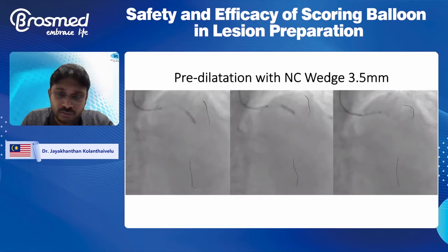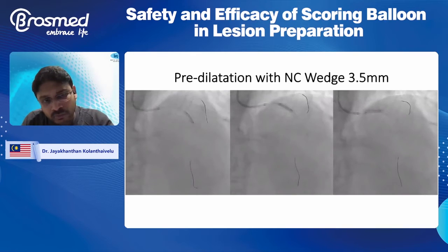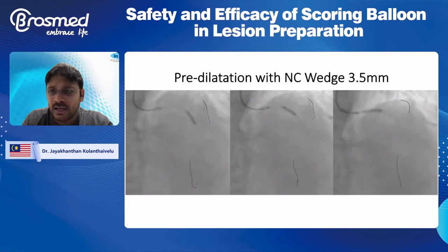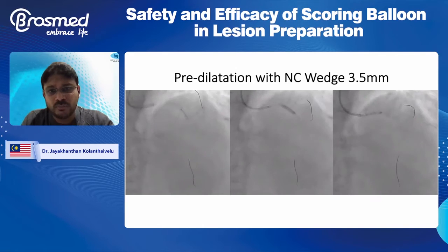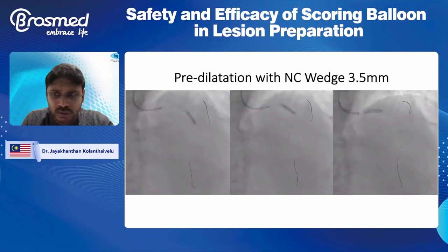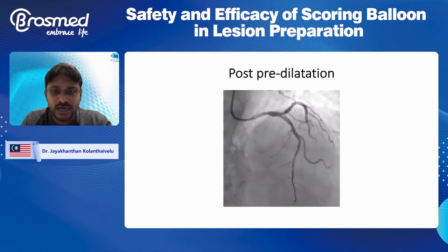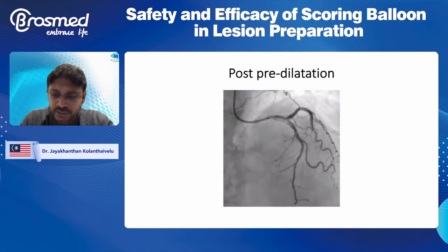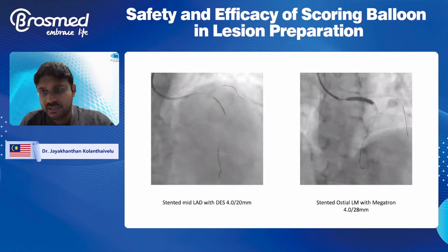So we actually used a 3.5 NC Wedge straight away. And you can see on the first image on the left-hand side the dog boning giving way at about 18 to 20 atmospheres. Thereafter, we stretched the ostium, which was very important to make sure the lesion preparation is adequate. We went up to high pressures without any problem, 22, 24 atmospheres. After pre-dilatation, we achieved very good results. We were quite happy, and thereafter we proceeded to stent.